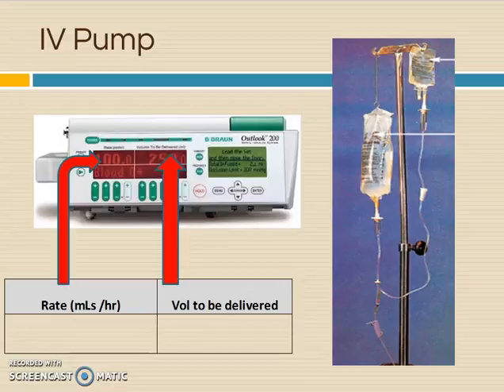So this is a piggyback situation, and what you have here is this IV, which has medication in it. This IV is hooked in to the primary IV. And since it's higher, it's going to go first.